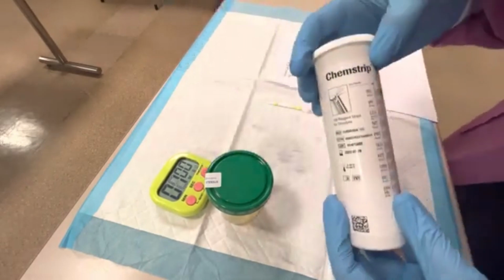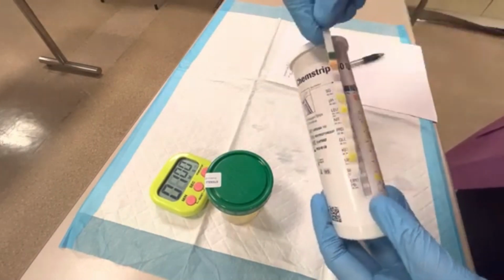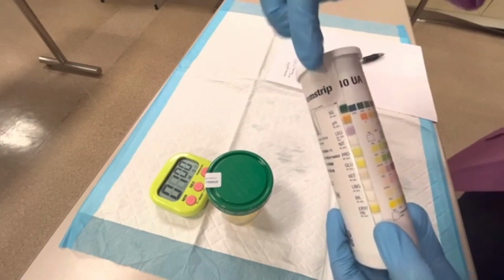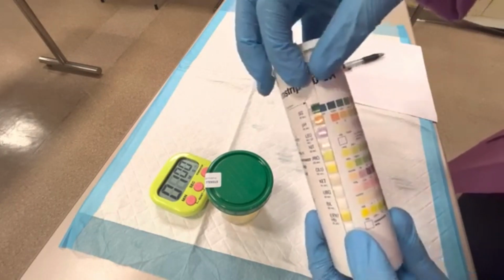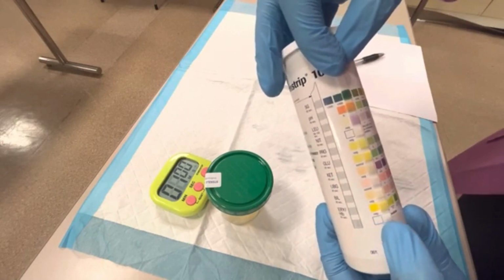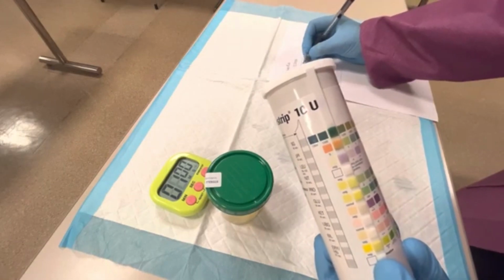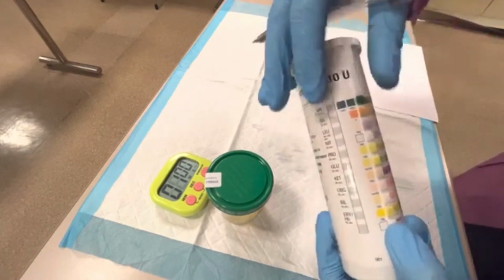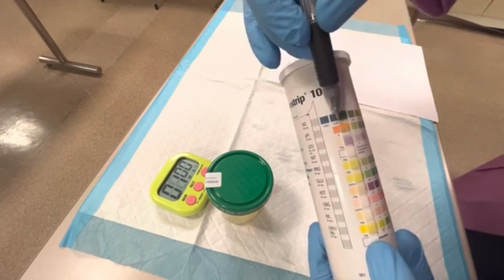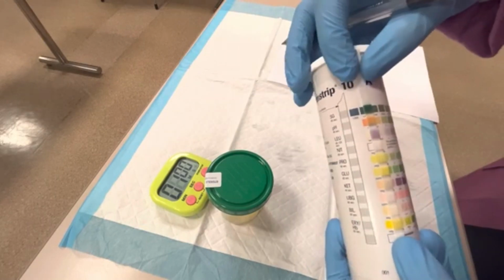Okay, so if you notice here, it says the strip handle is up here. So this is how we want to read it. For specific gravity, we're going to compare it to what color it looks like. It looks like 1.005 for me, so I'm going to write that down. All right, pH. Oh, that's right at 5. Excellent. So I'm comparing it to these colors. So 5.0.